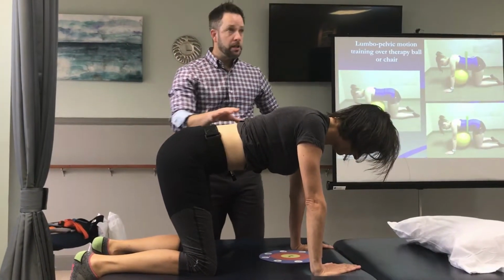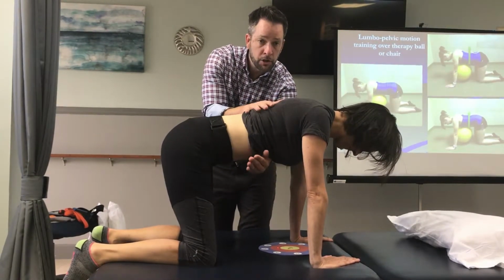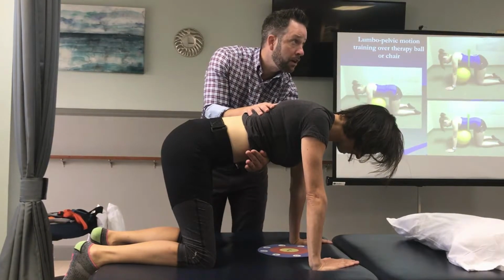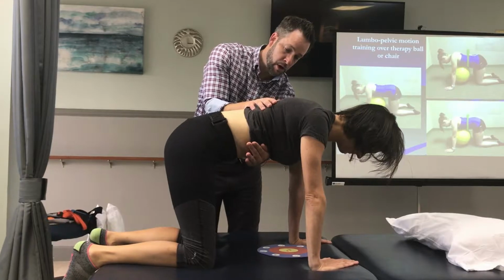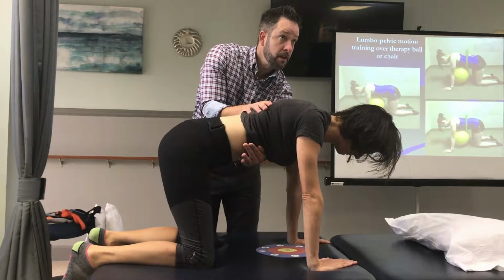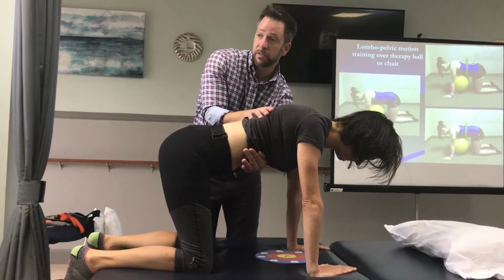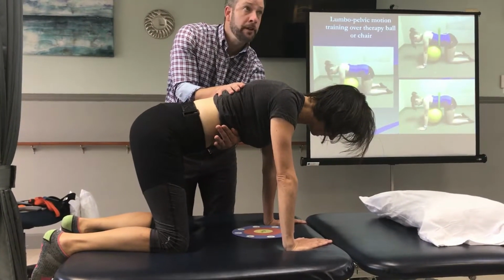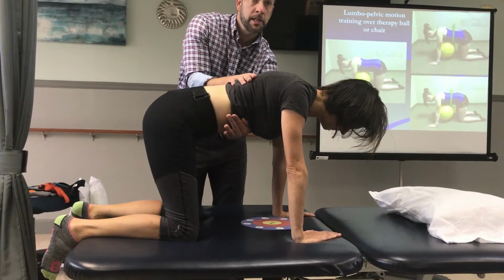So let's keep creating. This is a class. So I'm gonna come underneath here again. So I don't want you to move into my hands, but still try to move top of the target, bottom of the target. Okay. So smaller moves. There you go. Yes. I can't see the laser what's happening, but I'm assuming it's moving. It is. Okay. Good. So keep track. She's not moving into me anymore. Keep going. Yeah, good. Repetitions will lock this in, okay?